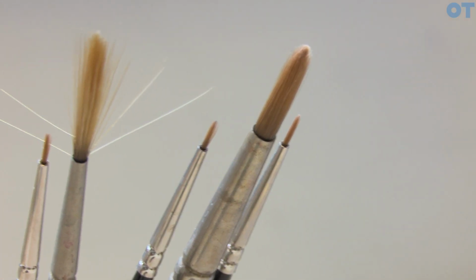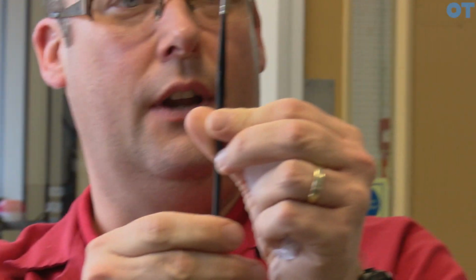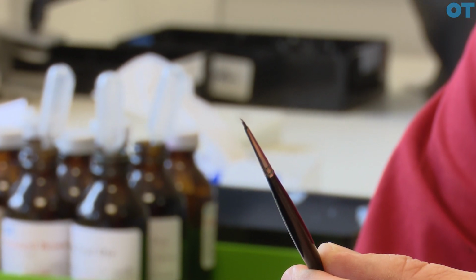Just need my main brush that I paint with at the moment. I also have a favourite brush, which is this one that I've cut down. It's got one hair, literally cut down to as fine as I can get it.